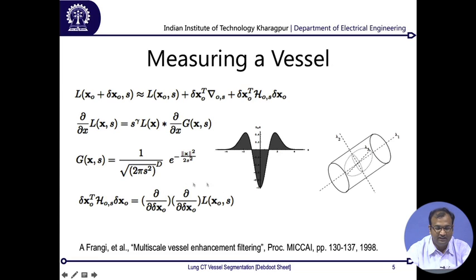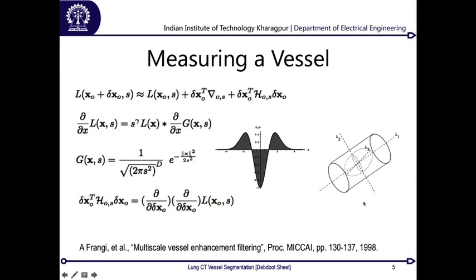Okay. So in essence, what would come out is a factor which we are looking at something like this. Say that there is a cylindrical structure. So your blood vessels, in the 3D space, are obviously in a small piece of volume. If you see, you would see a piece of cylinder. Now if I am traveling along the length of the vessel, then I would just be seeing these small cylinders going down along the length of the vessel.